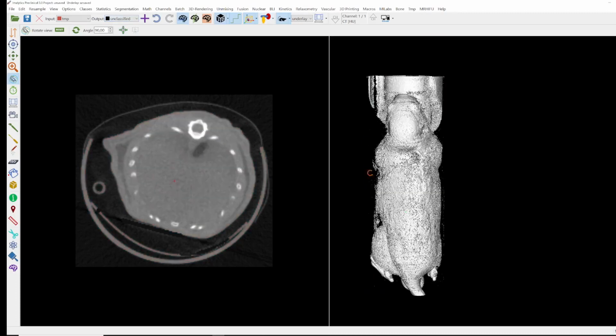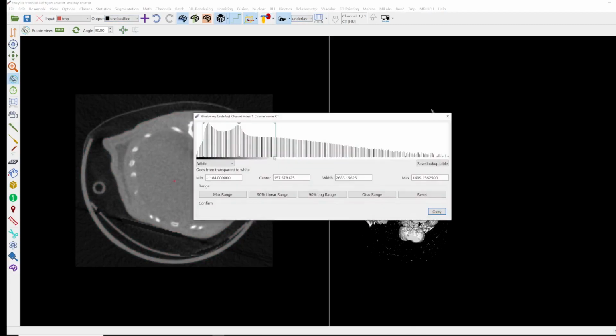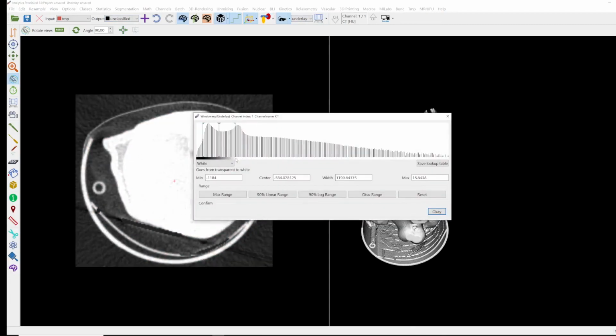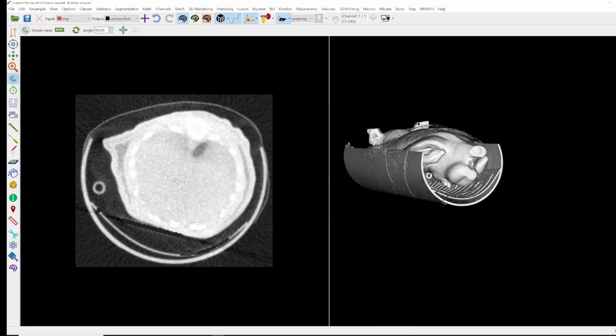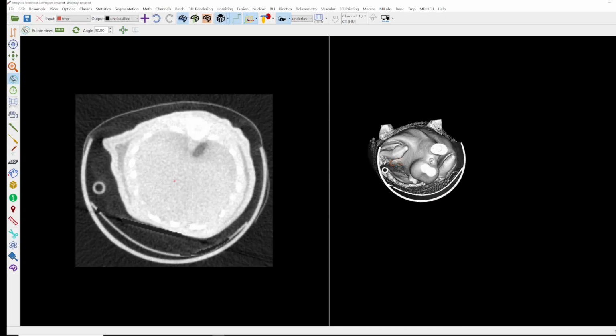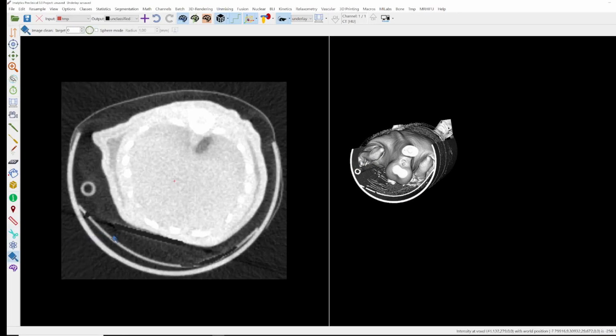Okay, now I will hide the segmentation because now we want to segment the bed or get rid of the bed. And to do this, I will use the image cleaning mouse mode. You can find it also in the mouse action toolbar. It's here on the left side, and it's visualized by this blue brush. We have to put it to -1000 again, because this is air, as I already explained. And now you can remove the bed in this way, like this.